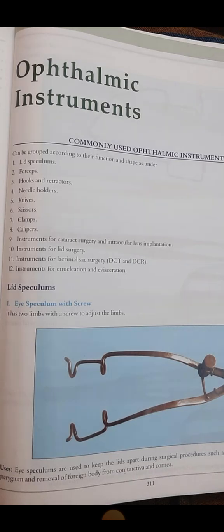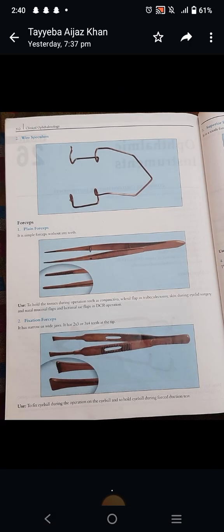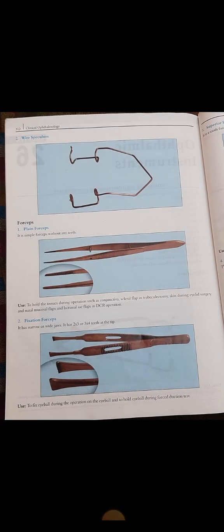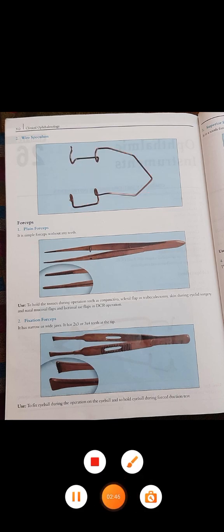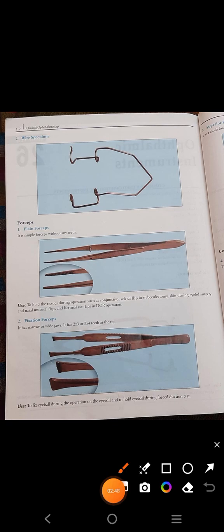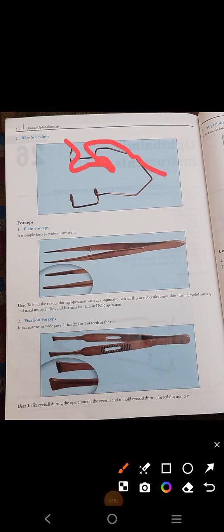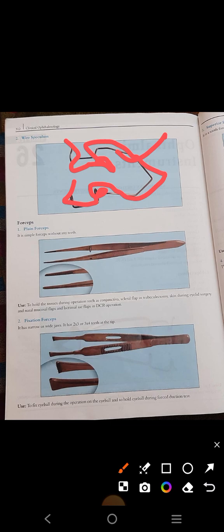The wire speculum is a very delicate instrument. You can see it has no screw — it is just a metal wire arranged or coiled to form this wire speculum. Its purpose is the same as the eye speculum: to keep the lids apart.